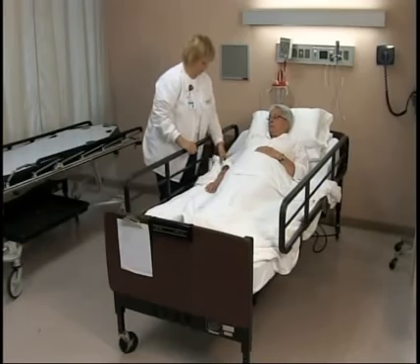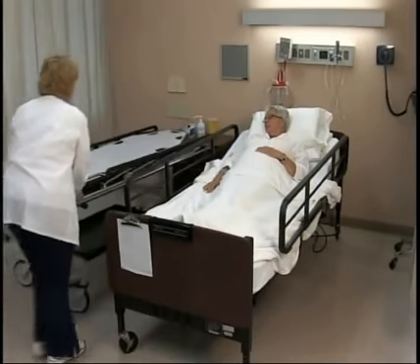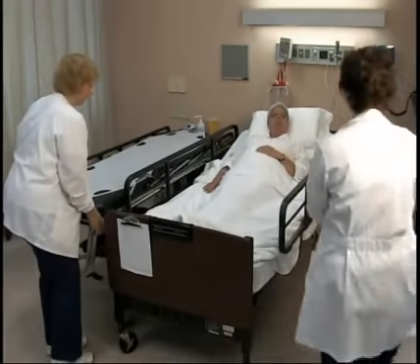Pull the stretcher near the bed, and call for some help. You will need 2 to 3 assists for this transfer.